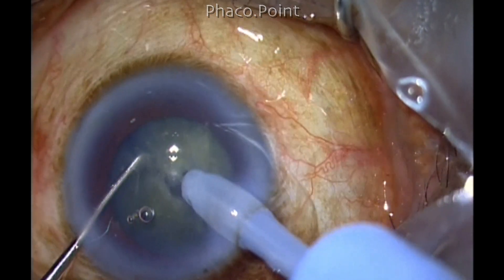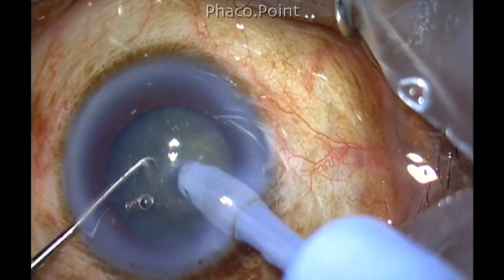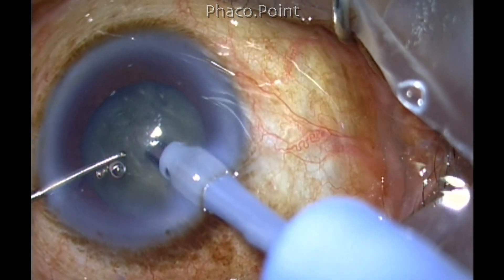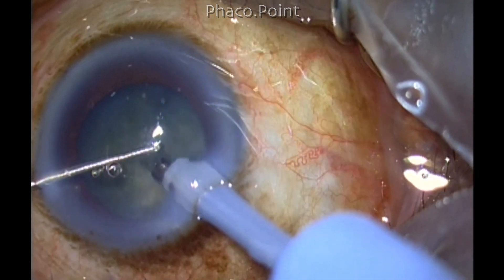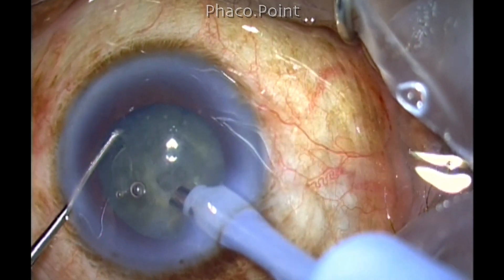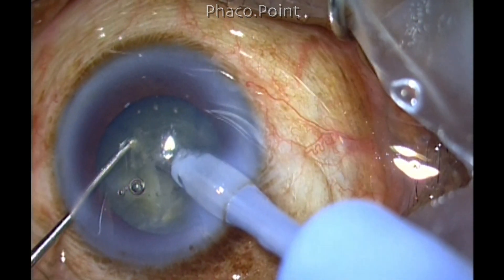So I'm doing a direct phaco chop technique. This is a grade 2 nucleus sclerotic cataract. In a harder cataract, you probably need to go to a 5.5 millimeter rhexis, because a small rhexis will definitely hamper your ability to create the chop and to mobilize the fragment. You see that I'm creating multiple small fragments even though it is just a grade 2.